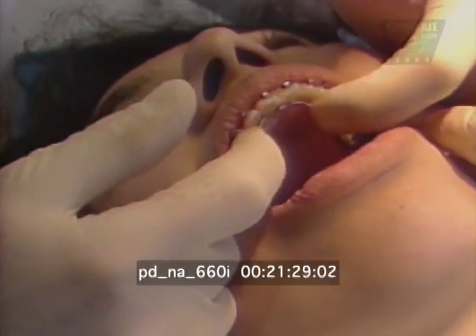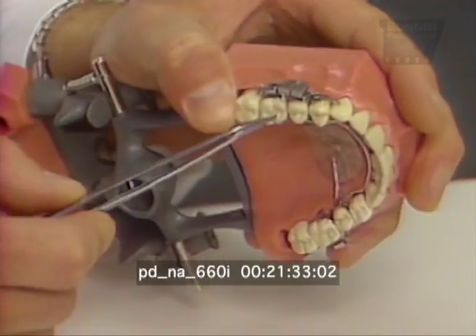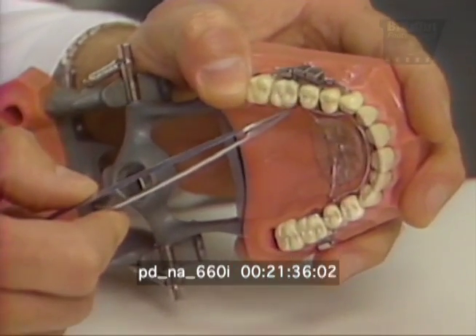The orthodontist first places a retainer in the top of the mouth to anchor the front teeth. Next, one magnet is wired to a molar, and the other magnet is placed on the tooth next to it. These repelling magnets have a tendency to get away from each other, and by doing so, they move the teeth away from each other.